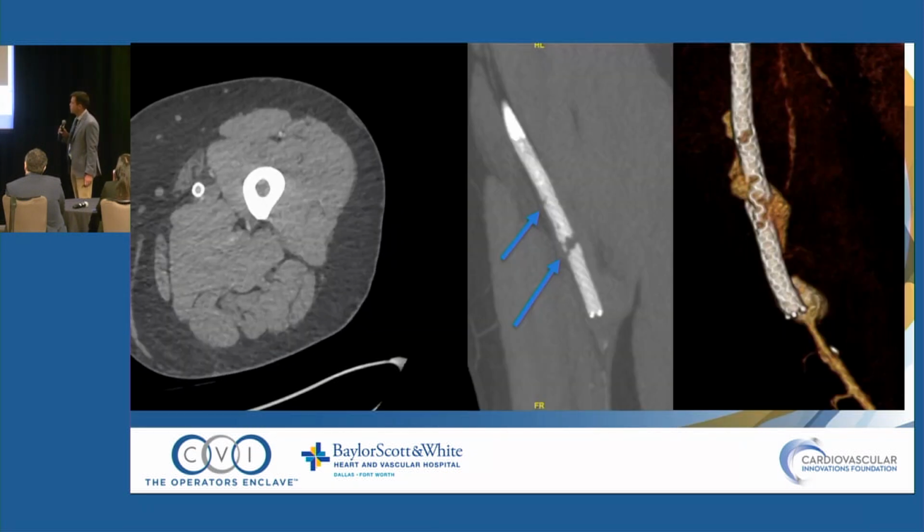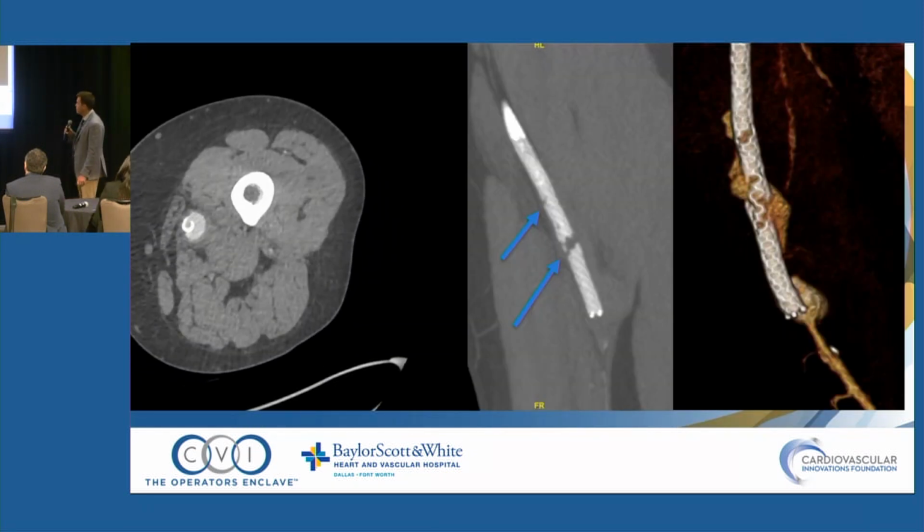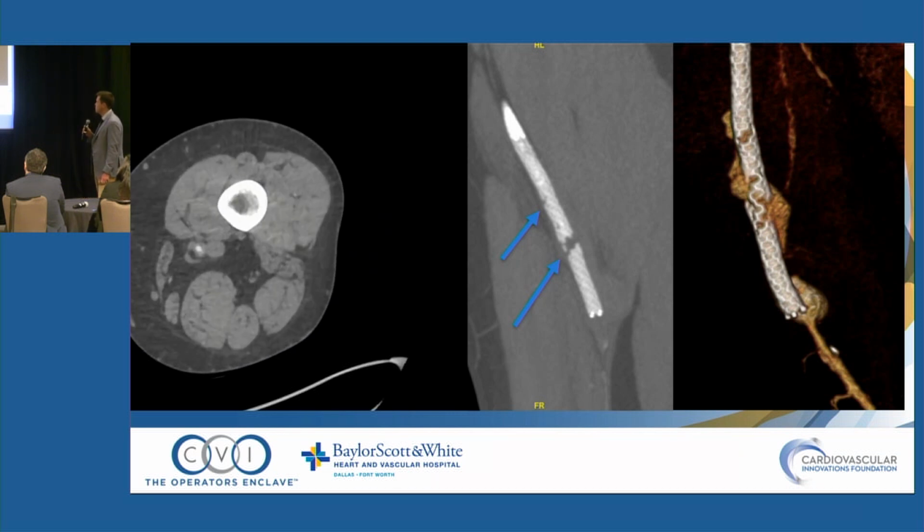Here's her CT scan as well. Let that run.